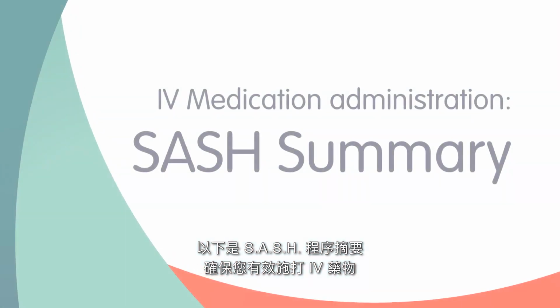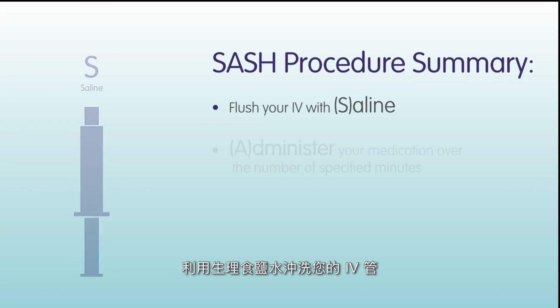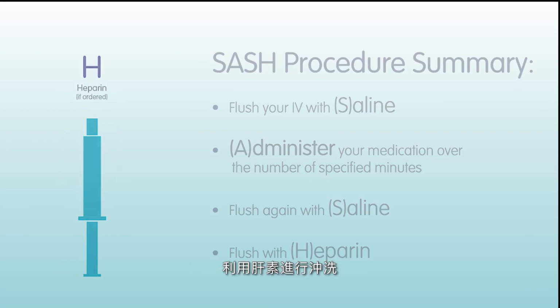Here is a SASH procedure summary to ensure you are administering your IV medication effectively. Flush your IV with saline. Administer your medication over the number of specified minutes. Flush again with saline. Flush with heparin.